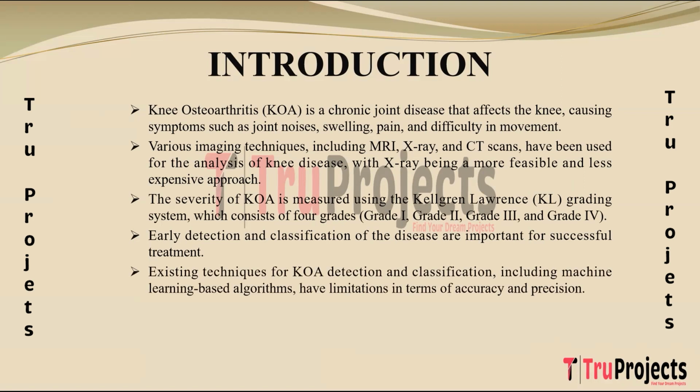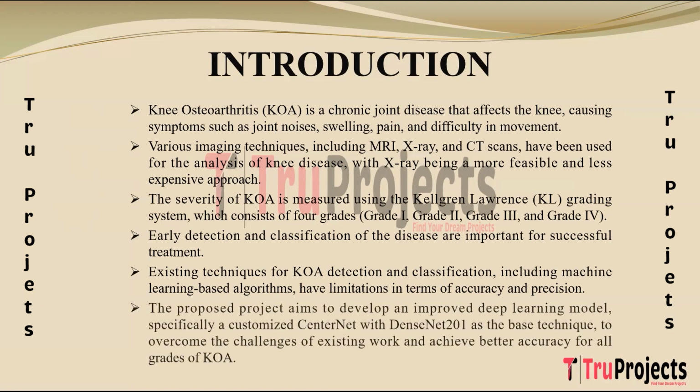Existing methods, including machine learning based algorithms for KOA, knee osteoarthritis detection, and grading, face challenges related to accuracy and precision. These methods struggle with accurately identifying subtle changes in joint structures or differentiating between varying degrees of disease severity. The proposed project aims to address these challenges by leveraging advanced deep learning techniques. It specifically plans to customize a CenterNet architecture utilizing DenseNet 201 as a foundational technique. This customization aims to enhance the accuracy and reliability of KOA detection and grading across all disease stages, potentially improving diagnostic capabilities and treatment planning in clinical settings.